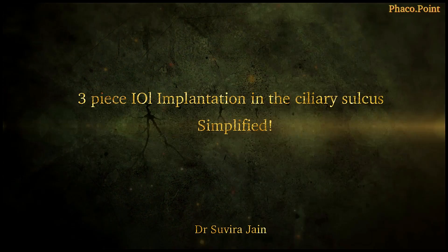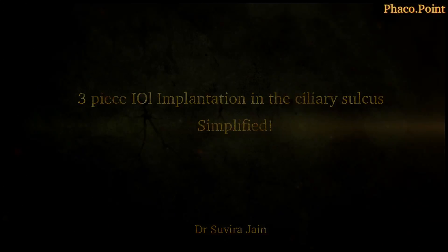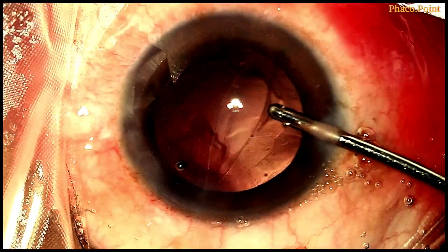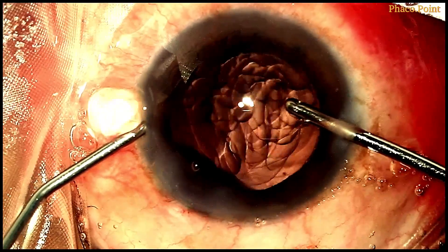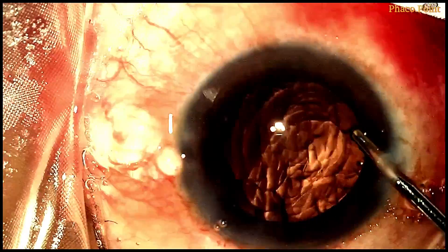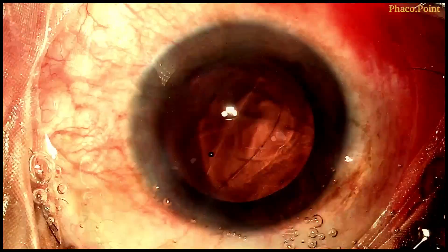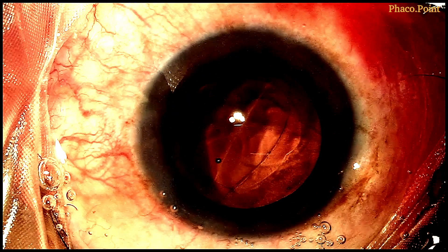Let's now learn how to implant a three-piece IOL. In this first case, a patient with a posterior polar cataract with an open posterior capsule — at the end of cortex wash, a visco-fluid exchange with the dispersive viscoelastic is performed.